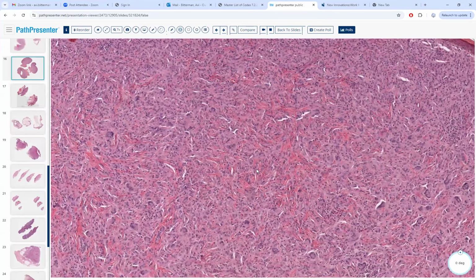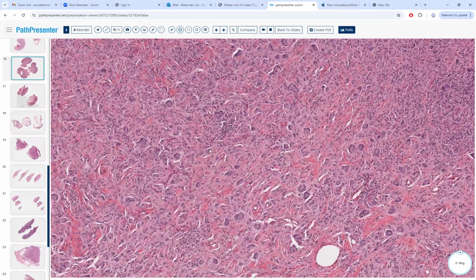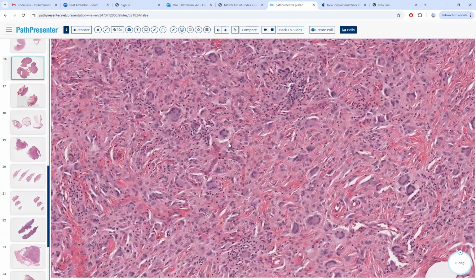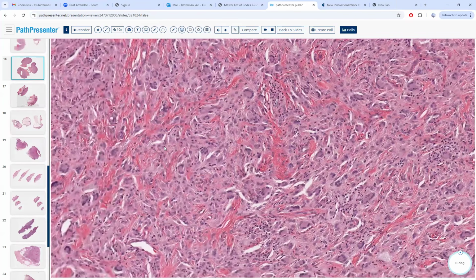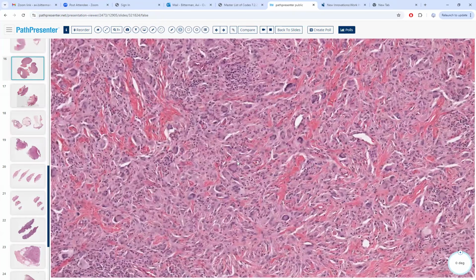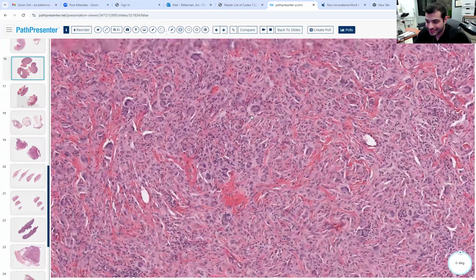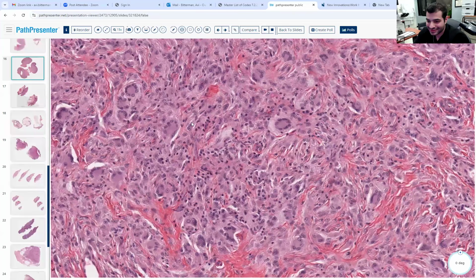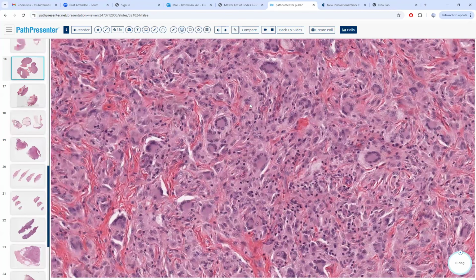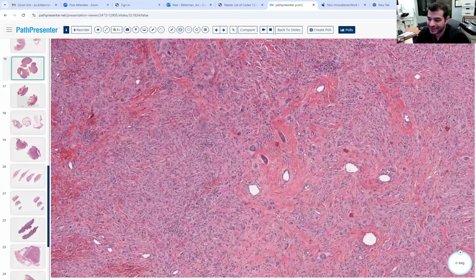Oh, it's like these ringed histiocytes as well, these wreath-like structures. Okay. Has that ring around it? Uh-huh. There's a lot of giant cells here. What kind of giant cells might they be? Look just like this. Are these Touton giant cells? Very good. Yeah. Touton giant cells. And sometimes you can get other cells in the infiltrate as well.